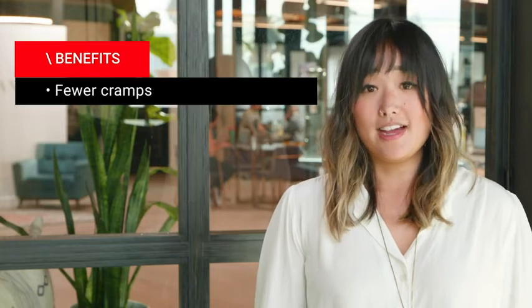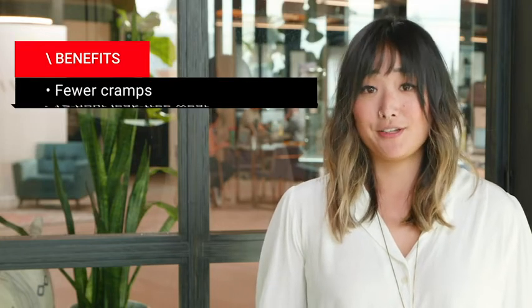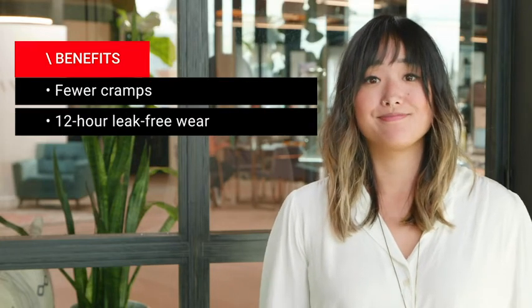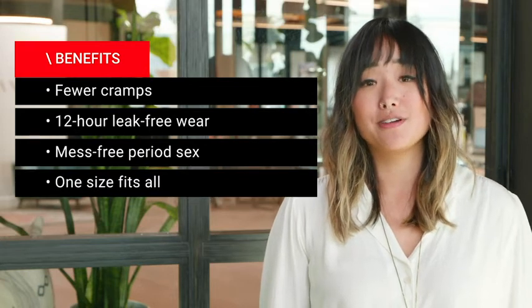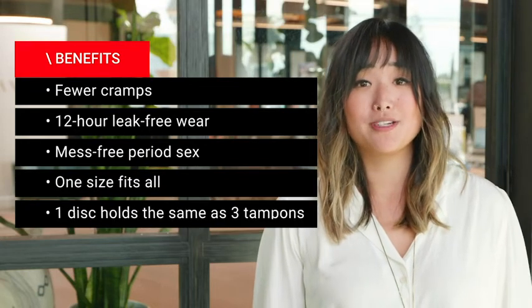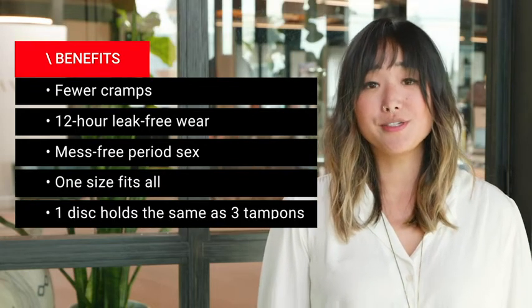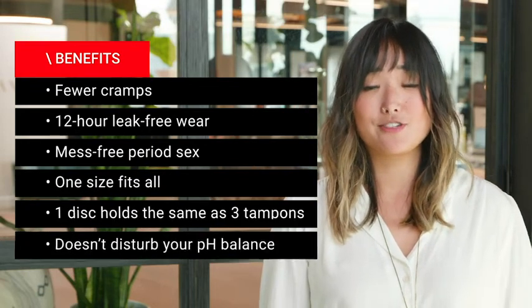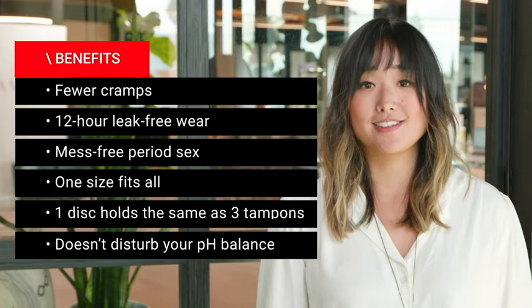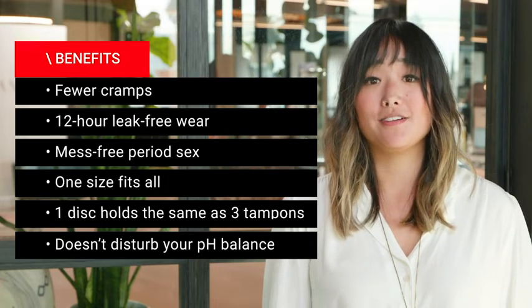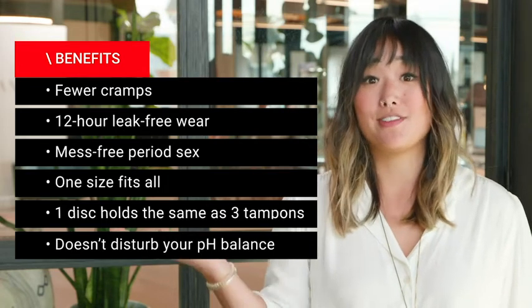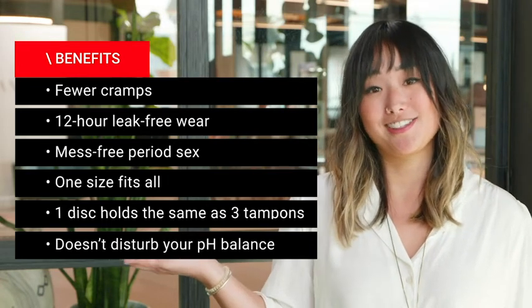So now that you've got the disc inside of you, what can you expect? Well, expect a reduction in cramps, 12 hours of uninterrupted worry-free use, and even mess-free period sex. Feel free to pause the video in order to see the rest of the life-changing benefits.